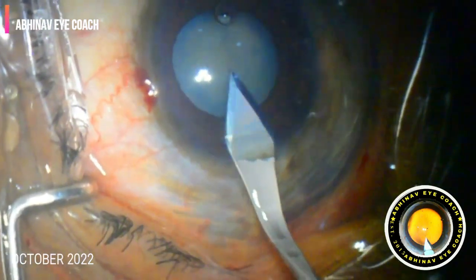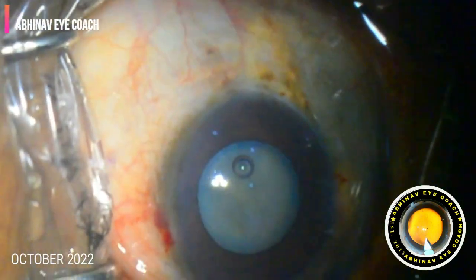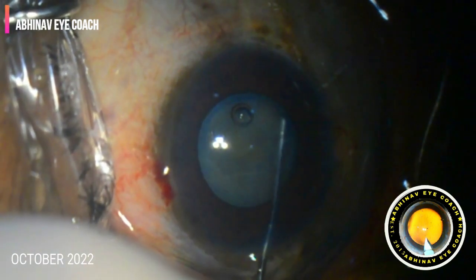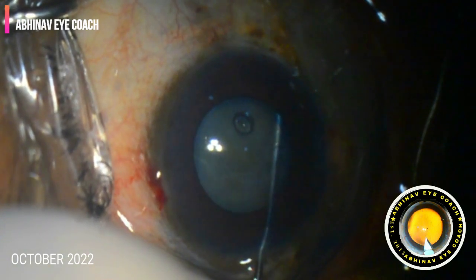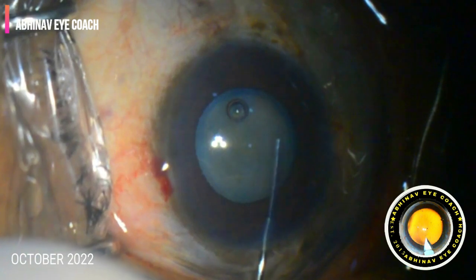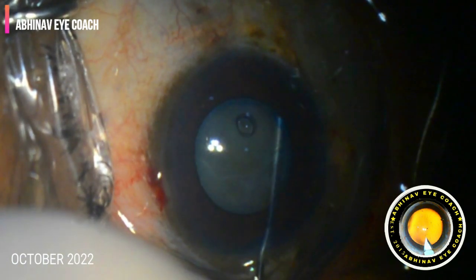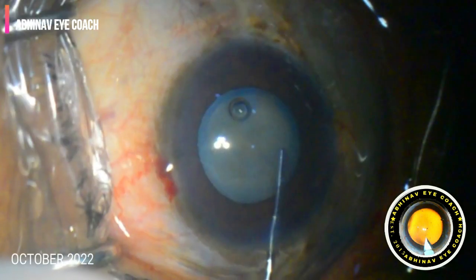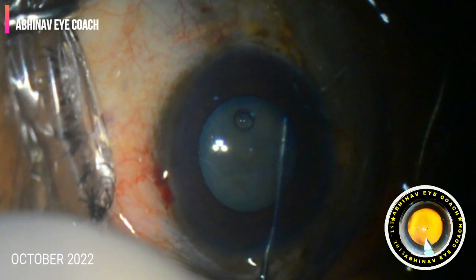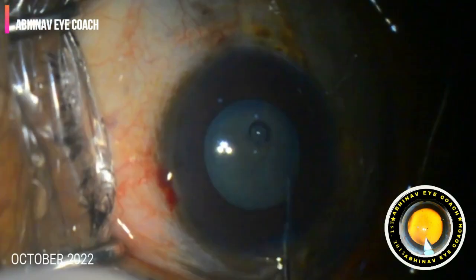We proceeded with the main port, having already planned a routine phaco. We started doing the hydrodissection, and until this point everything was going well. But at this point we saw a sudden snap or jerk as we introduced the fluid between the posterior capsule and the nucleus. As I push the fluid for hydrodissection, there is a jerk — a snap. There is a sudden deepening of the anterior chamber depth. This is what we call the snap sign.